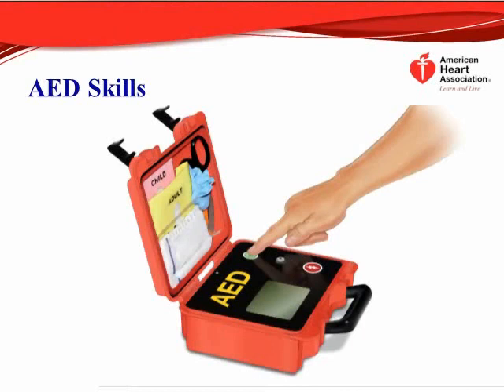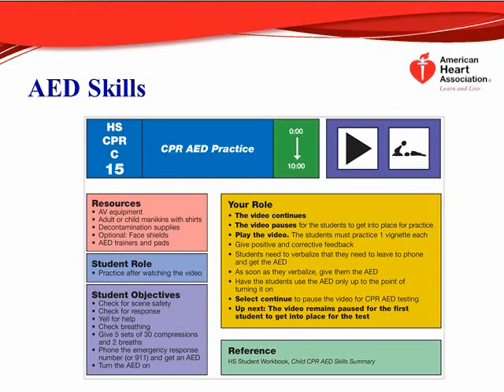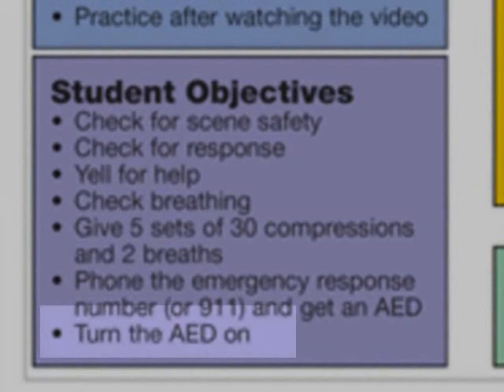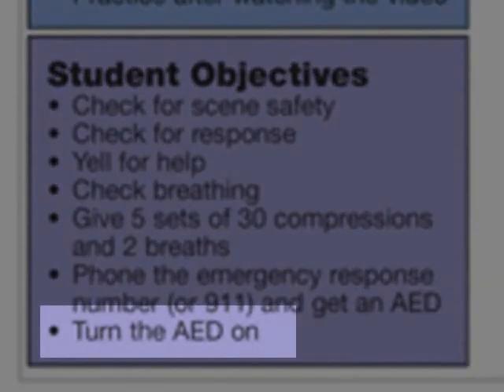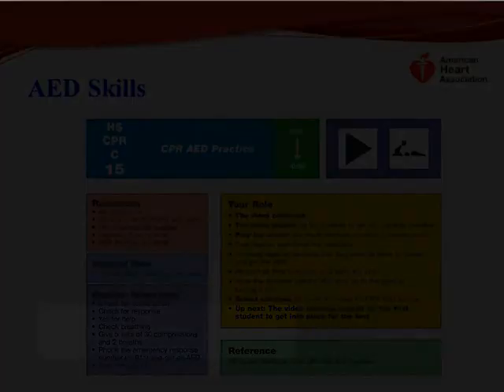It's the ability of a person to do what he or she is being told to do, and memorizing the prompts could complicate learning. So you'll see course content on using AEDs is now simplified, and the lesson on using an AED is a short practice that focuses on the psychomotor skill of turning on the AED. This means that students are tested only on turning on the AED.